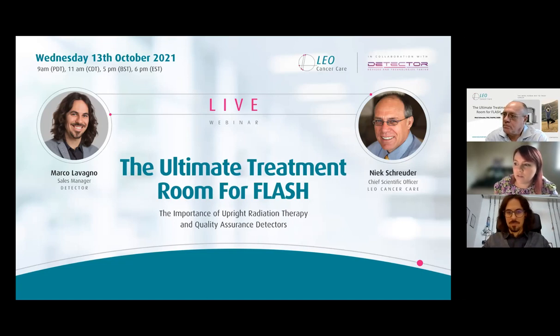Then we've got another one. How easy or fast would it be to switch the patient positioner from upright to supine? I have to clarify that. This is currently in our design primarily focusing on an imaging device so that we can image supine. We think about 5 to 10 minutes to pull the backrest out, put the new device on top, and convert it. Now, if you're in the treatment room, it's not going to be very easy to do full isocentric rotation if the dual imager is installed in the same place. So that discussion becomes a little more complicated. Also, how are you going to do image guidance in the supine position? To answer your question, in the pure diagnostic imaging space and the ADAP apparatus, we're aiming for a time of 5 to 10 minutes to do the conversion.